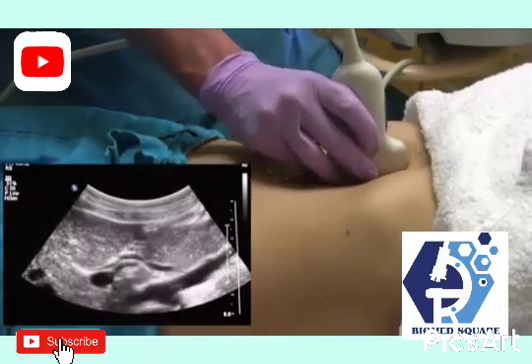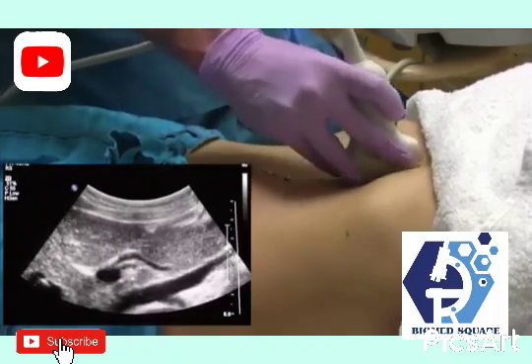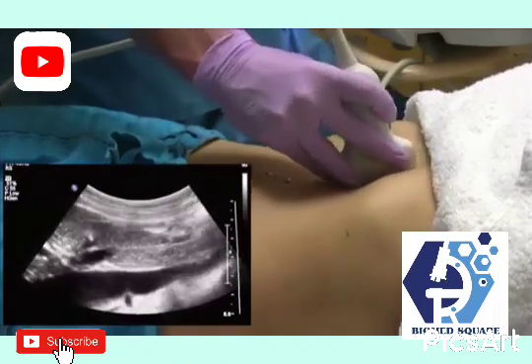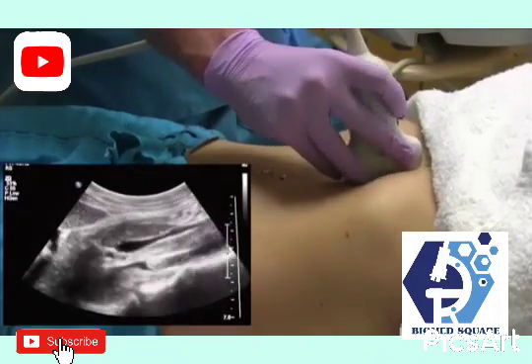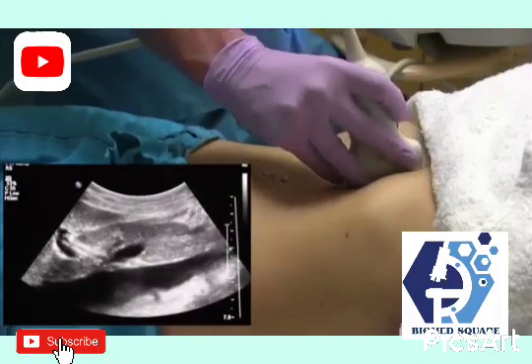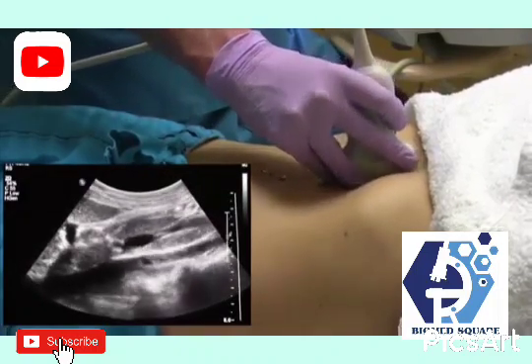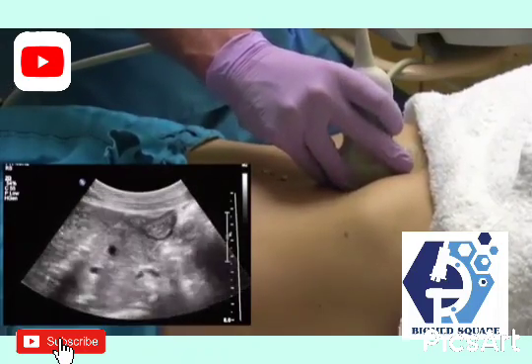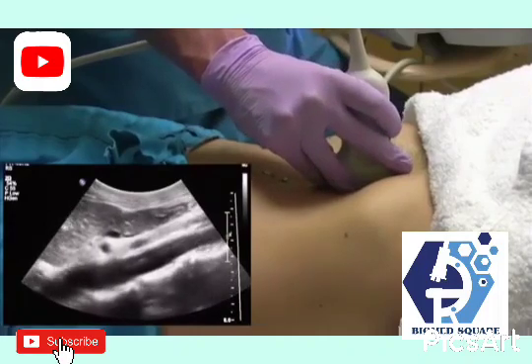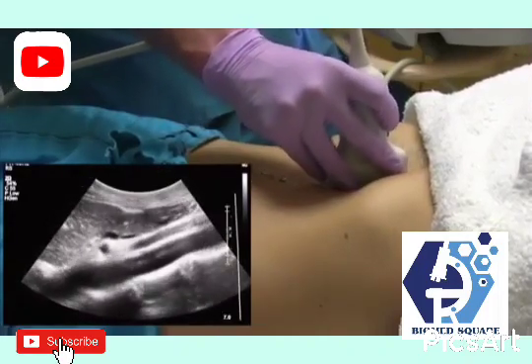If you do see anything in the pancreas also, you could get transverse images of the pancreas, which for that your probe will be in a sagittal plane to the patient's body. As you sweep through the pancreas in a sagittal plane, you can use other structures as your landmarks to know where exactly you are within the pancreas.